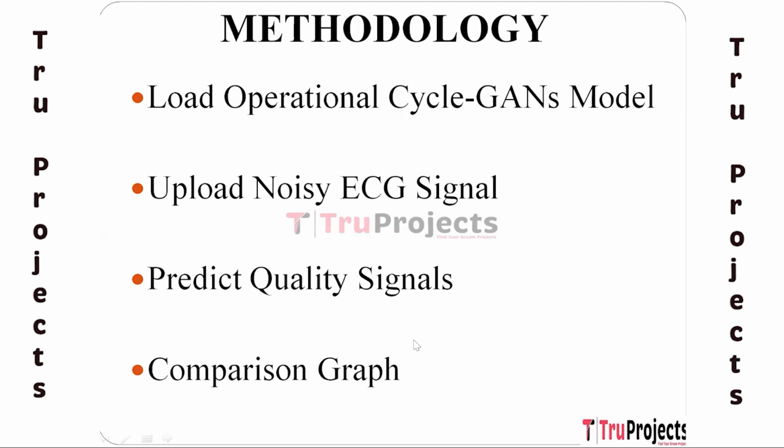Methodology. To implement this project, we have designed the following modules. The first module is Load Operational Cycle GANs Model. In this module, the pre-trained operational cycle GANs model is loaded into memory. The operational cycle GANs is a variant of the original cycle GAN architecture designed specifically for ECG signal restoration. The model is likely trained on a large dataset of clean ECG signals and their corresponding noisy versions.